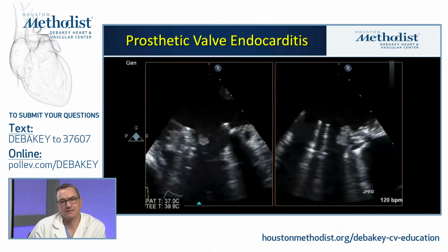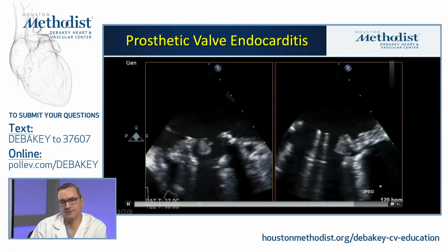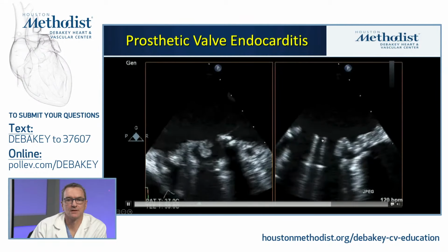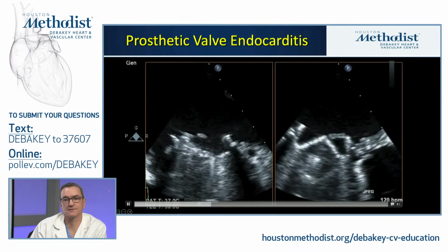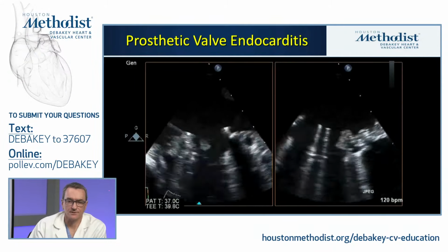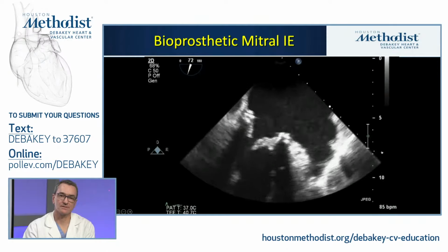This is another case of a mechanical valve in the mitral position, and it demonstrates one of the hallmark features of mechanical endocarditis. You see the wiggling mass here on the right image and also on the left image. And note, it's rarely ever attached to the pyrolytic carbon surface of the actual leaflet, but much more often attached to the surgical ring. And this case manifests some concern about actual obstruction by the mass. Quite different is the scenario with a bioprosthetic valve.